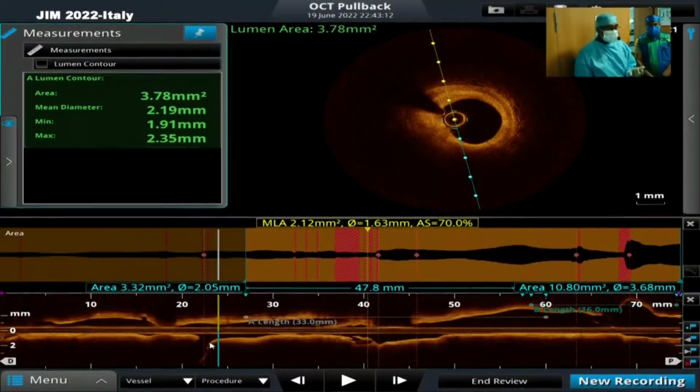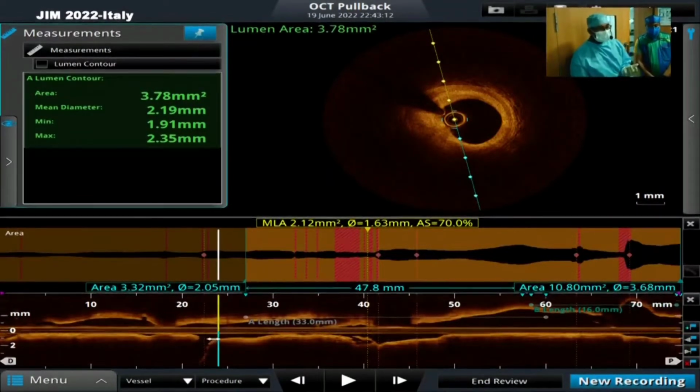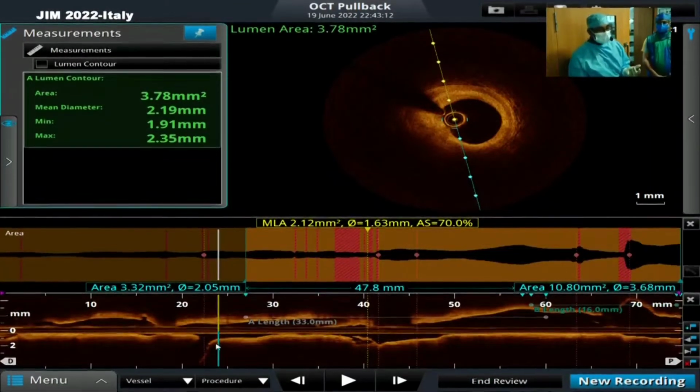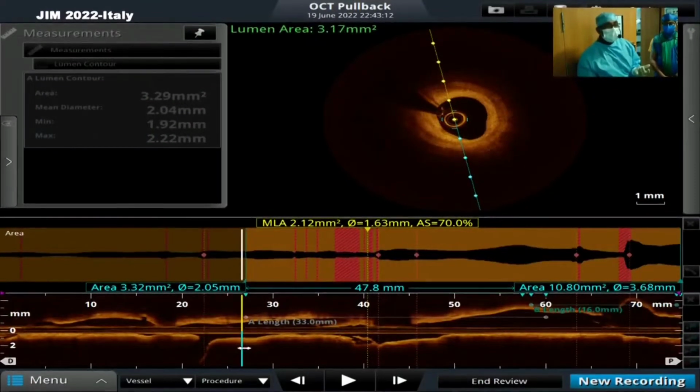be very unlikely based on the OCT criteria, because the angle is a wide angle. It's not a narrow angle. As well, the BPCT length is also good. So if at all we had to position the stent beyond this particular branch, we are unlikely to lose this particular branch. Well, now as we come more proximally, based on angiography, this is what we had in our mind.